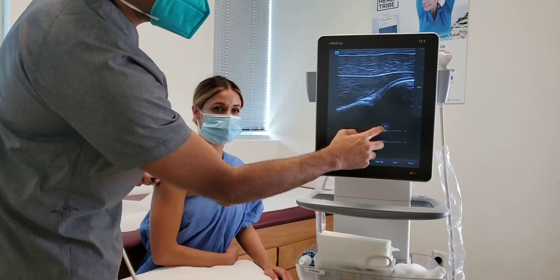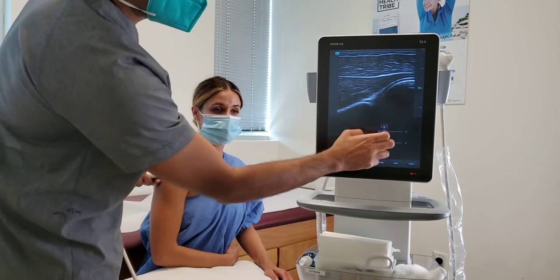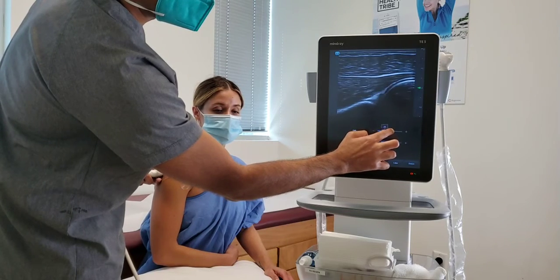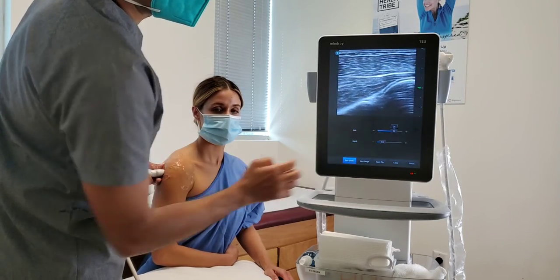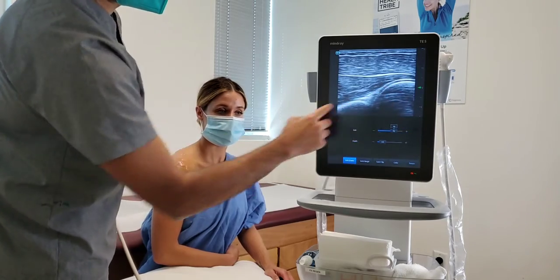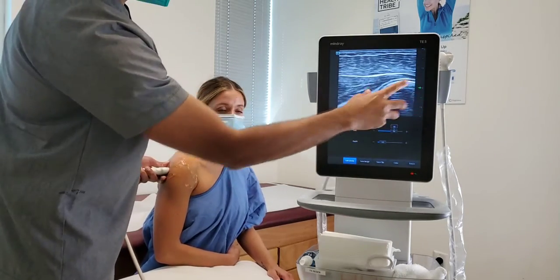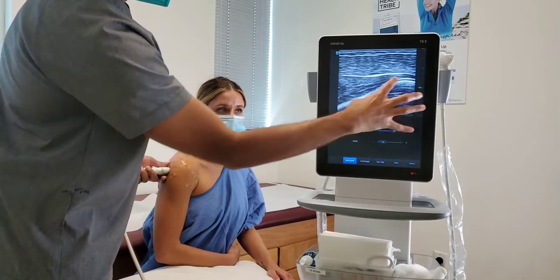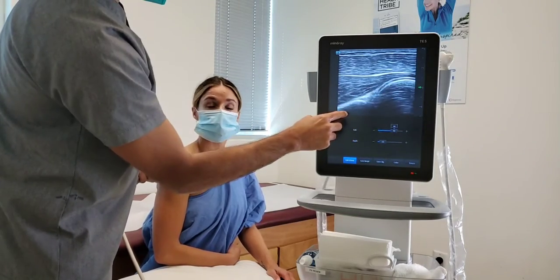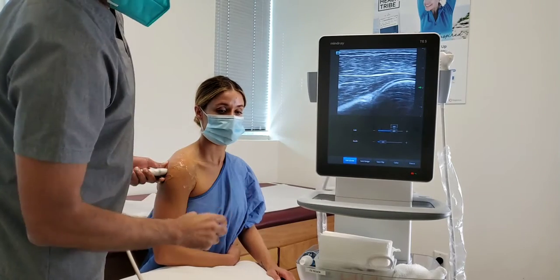And I'm just going to increase the gain a little bit here. Make this a little bit easier for us to see. Okay. So hopefully it's a little bit more clear. Again, here's the ball and the socket. If you turn your head sideways, it kind of looks like a golf ball sitting on a tee or an ice cream on a cone. That's the ball and socket joint. And this bright white triangle right here is a part of the labrum.